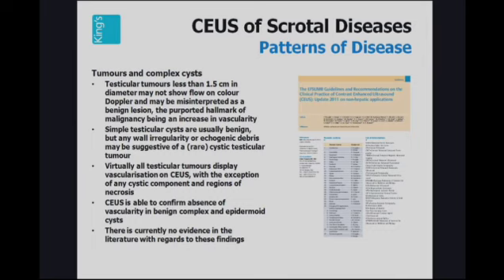Nearly all testicular tumours will demonstrate vascularization on contrast-enhanced ultrasound. Therefore, contrast-enhanced ultrasound is useful to confirm the presence or absence of vascularity. There is, however, very little evidence in the literature with regards to these findings, and a lot of this is based on personal experience.